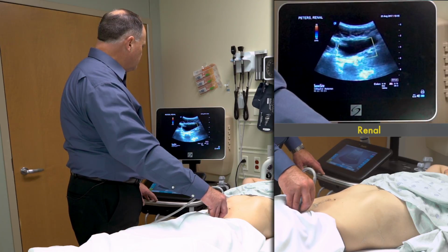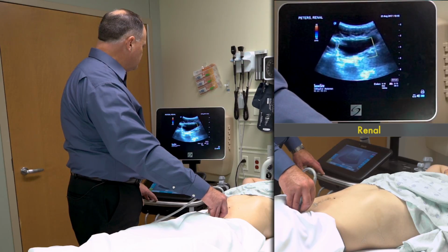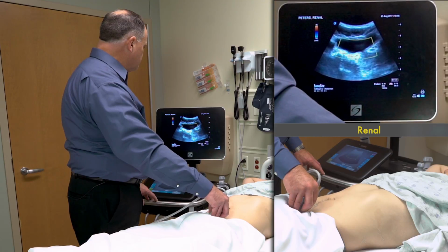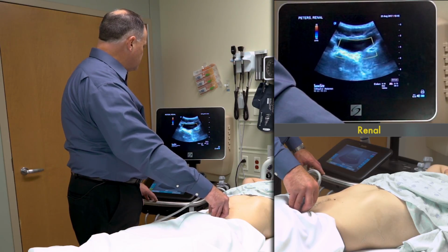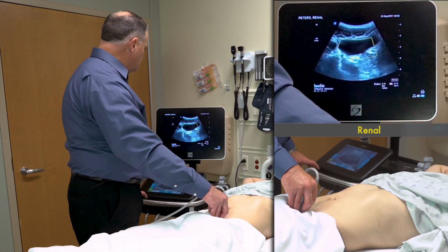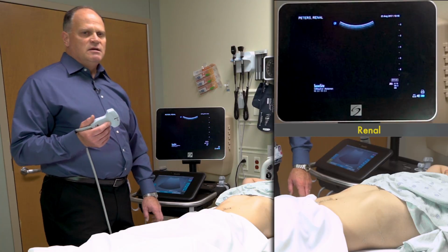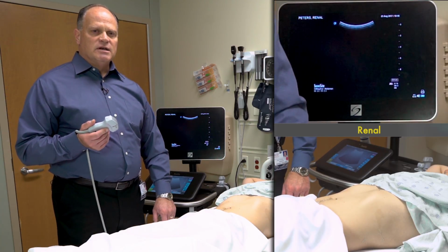And we'll see if we can pull one in real quick. Not seeing the jets. So again, the renal ultrasound is going to look at both kidneys in the long and short axis, and we're going to look at the bladder in the long and short axis.